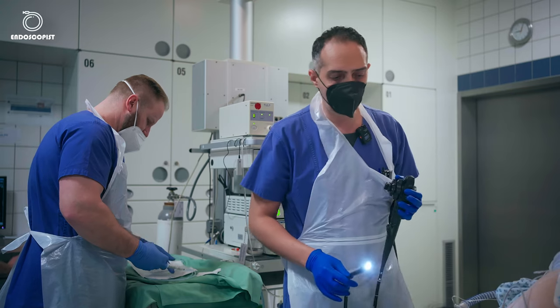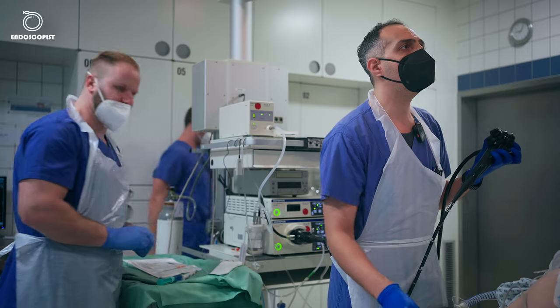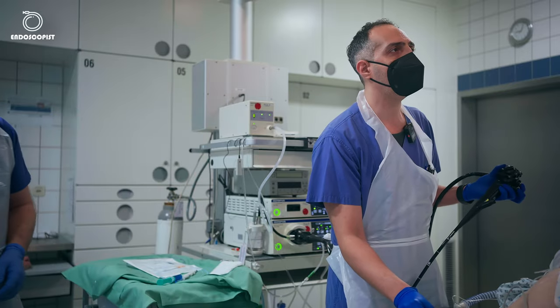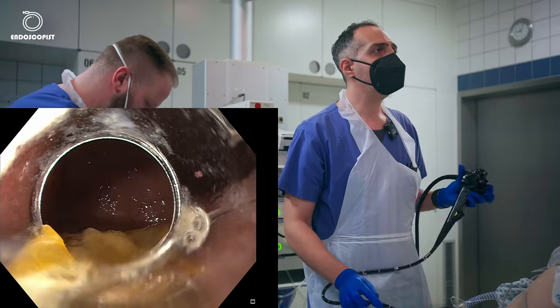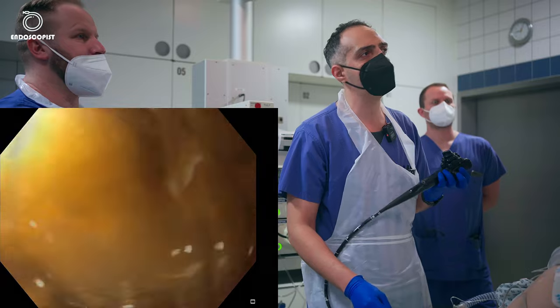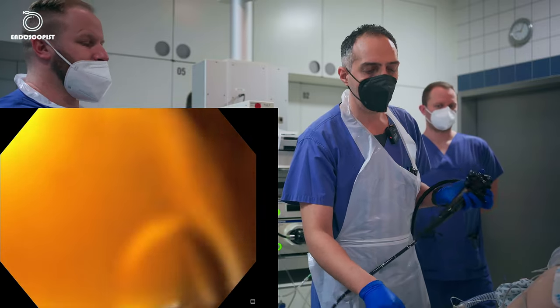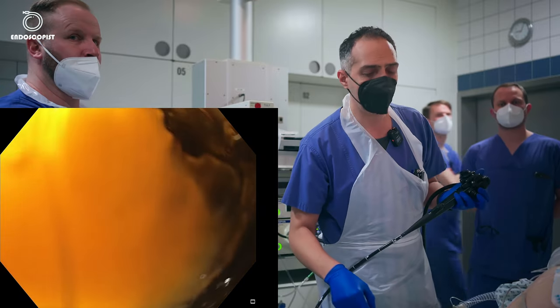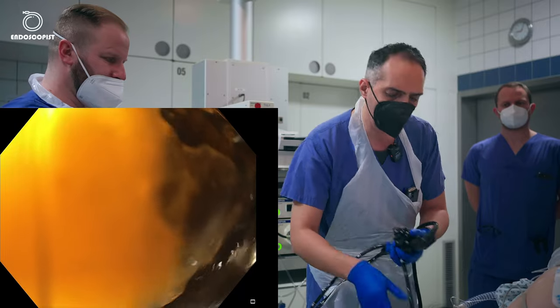So we'll start now by doing upper endoscopy. We know that this is type 1 achalasia. So we start the upper endoscopy. We've just intubated the esophagus. As we can see here, there is remnant food, which is very common with achalasia. The patient is intubated, that's why we have a very low risk, or no risk, of aspiration.